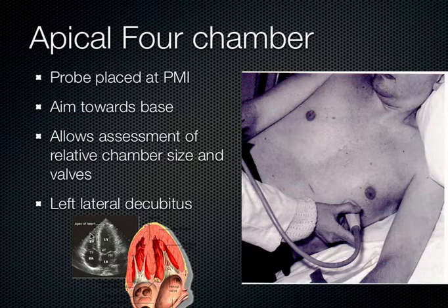As the right ventricle gets bigger and bigger, there could be some problems, with the right ventricle trying to pump blood against an obstruction like a pulmonary embolism. In the setting of massive pulmonary embolism, or blood clot in the lung, the right ventricle gets so big it approximates the size of the left ventricle. So that's how I use this view clinically.